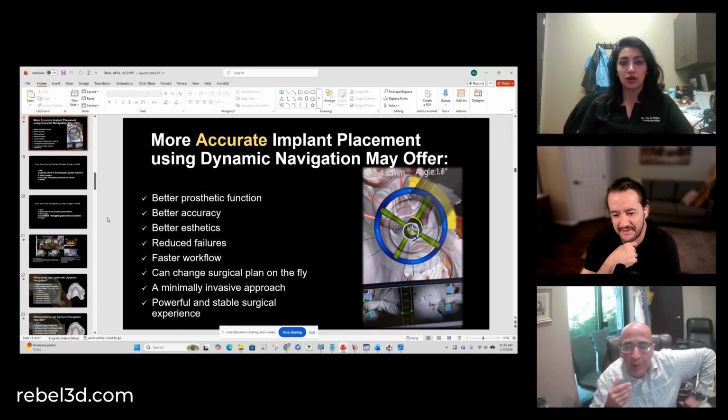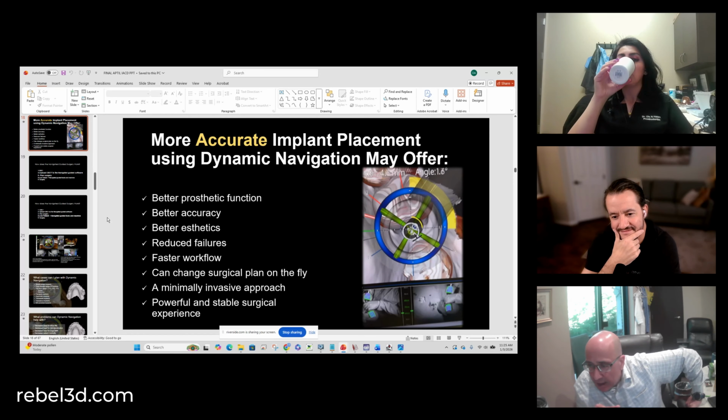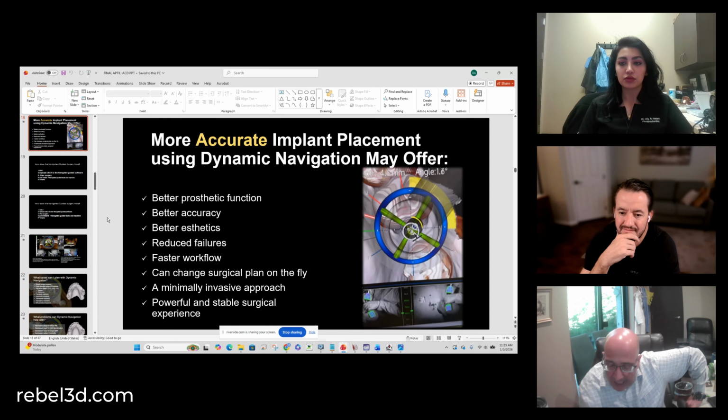Actually, I would say we were the first to have been doing this, and everybody was telling us that we were wasting our time. I didn't care about this opinion. I saw it is the best for me. The patient finishes, and I have a very good anesthesiologist with me. We do intubated general anesthesia. We finish the surgery within 30 minutes, 45 minutes at most when it's complicated.